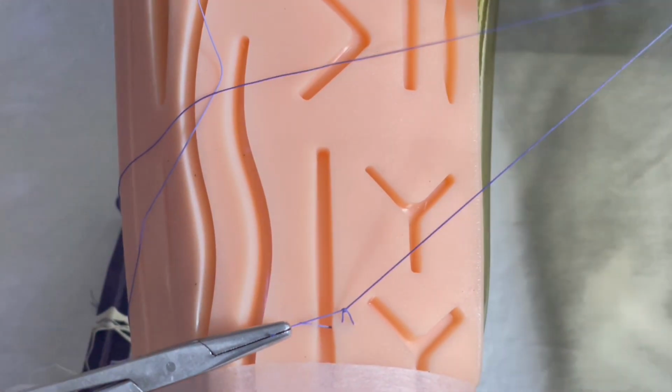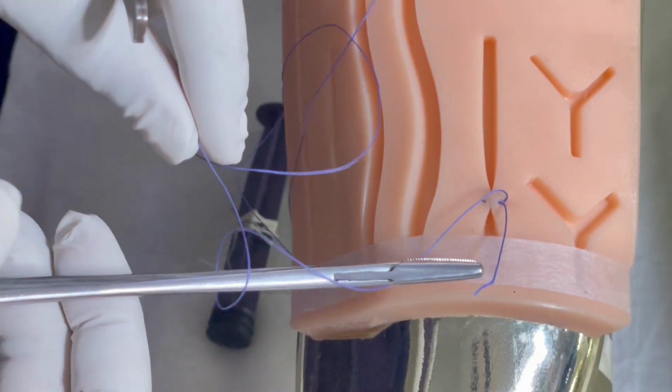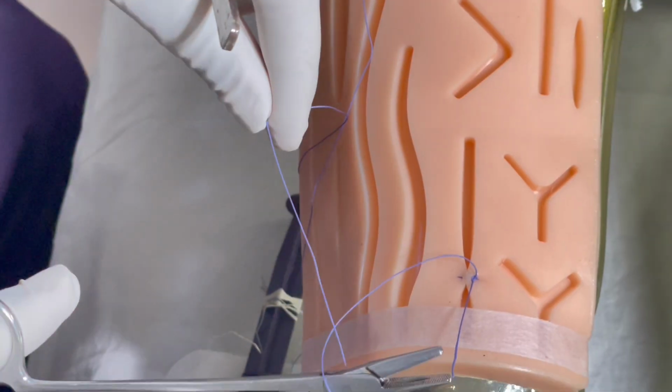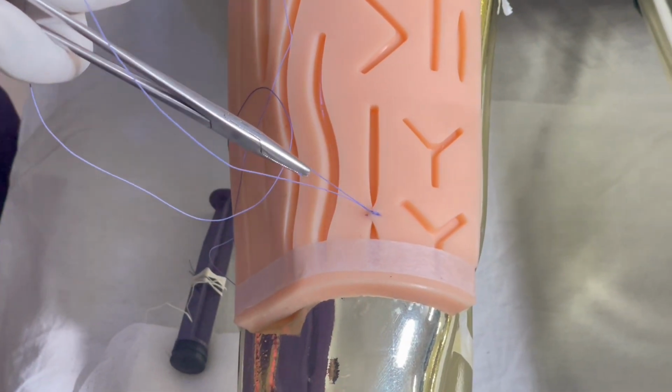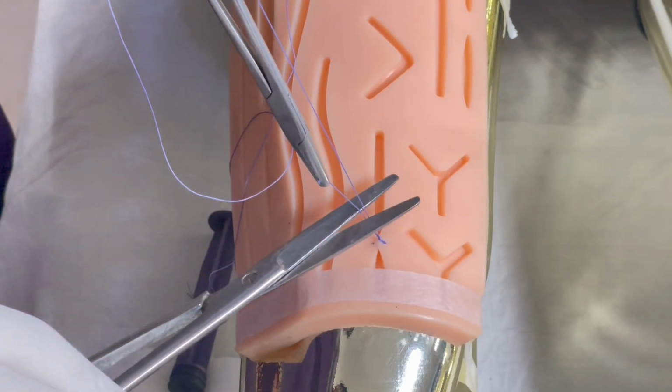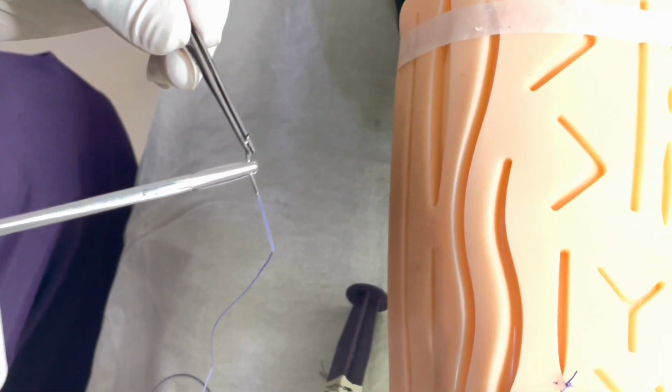Take 2 rounds, first in one direction, then 1 round in the reverse direction, then cut with the scissors. So this is one vertical mattress.